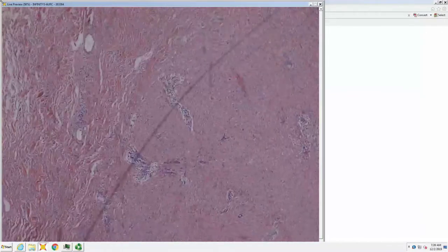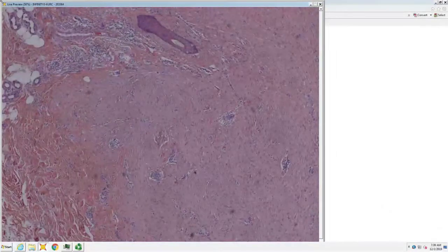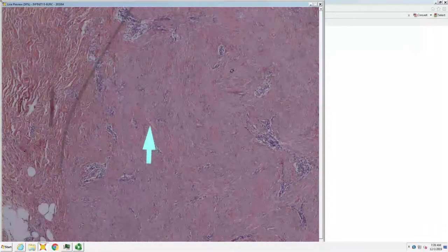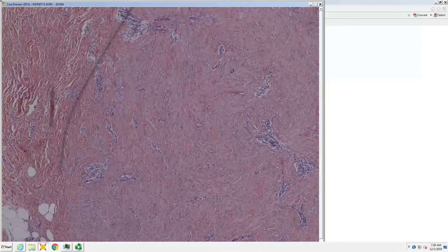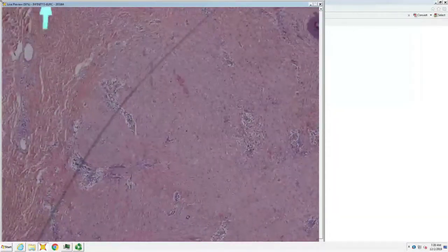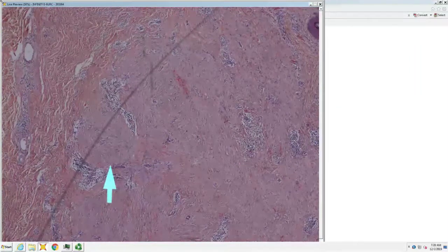Nodular fasciitis tends to be deep in the fascial sub-Q plane, and tends to be very loose and myxoid. This one is forming ropey collagen and distinct nodules, which is hypertrophic scar. In ordinary scar, all the fibroblasts run parallel to the surface and the vessels run north-south. In hypertrophic scar, you have nodules forming. If it forms thick bubblegummy collagen, then it's a keloid.